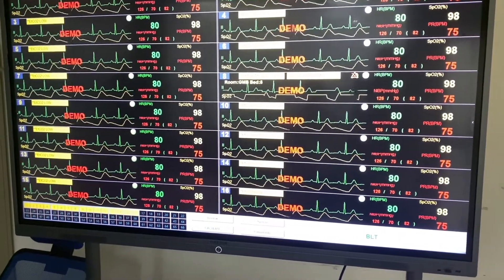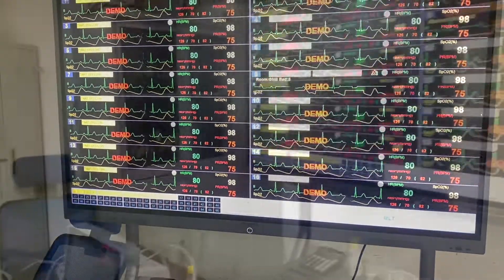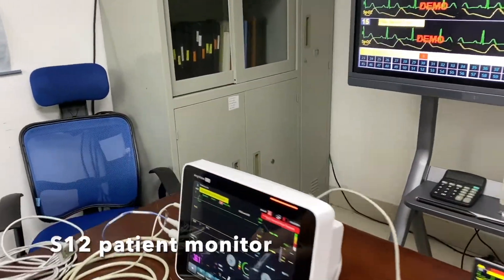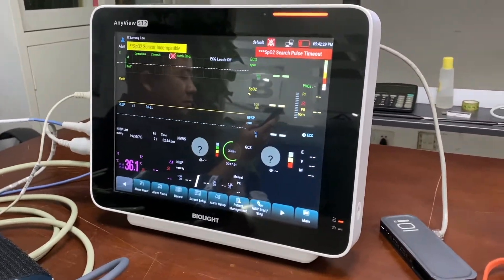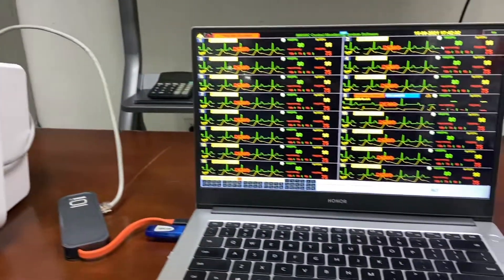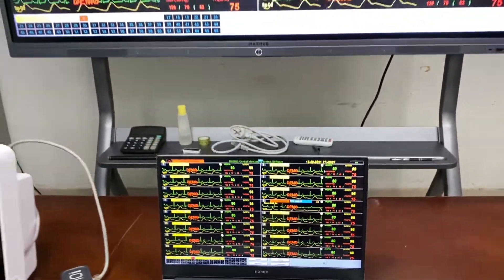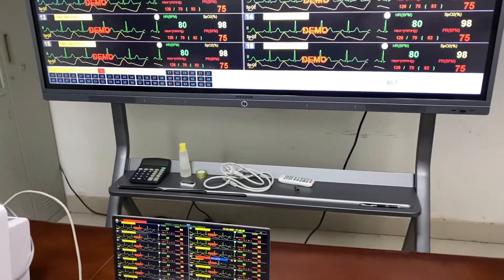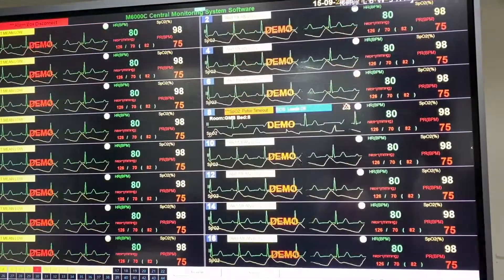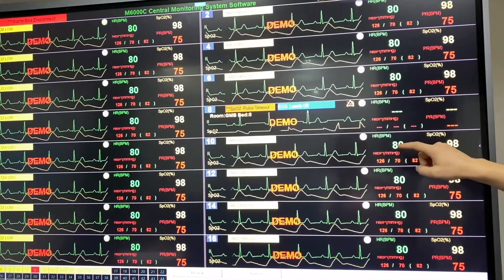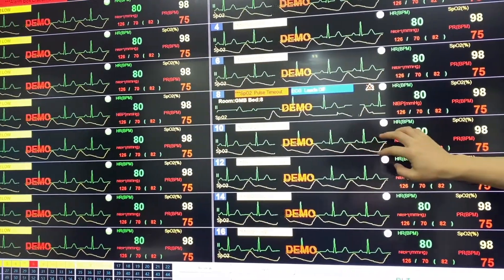As you can see, we can display up to 16 beds at the same time on one single display. We also have an S12 connected to the central monitoring system over here, and also a secondary display. When using the central monitoring system we will be able to see two waveforms at the same time.